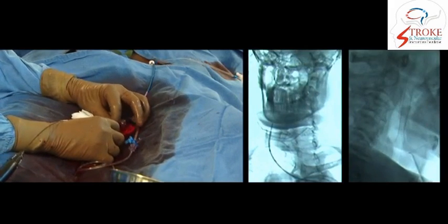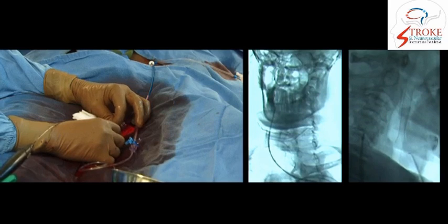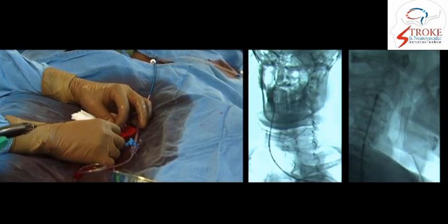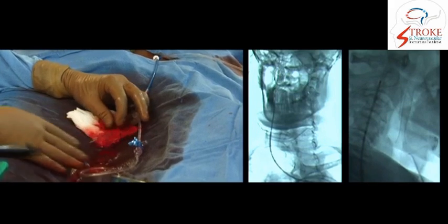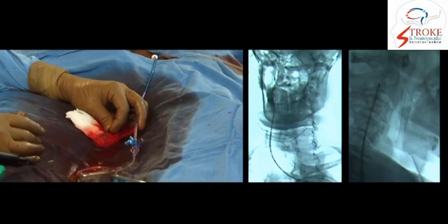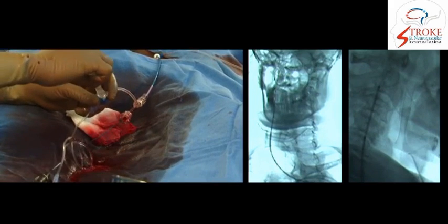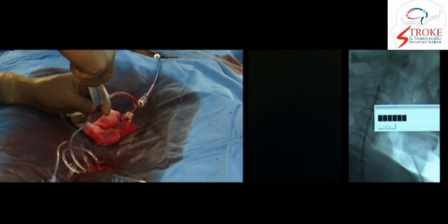And here you can see the stent coming out of the guiding catheter. We are using the vertebral body as a landmark to know the location of the stenosis. You can see the stent being taken across the stenosis. It passes quite freely. We take an injection to confirm the exact positioning.